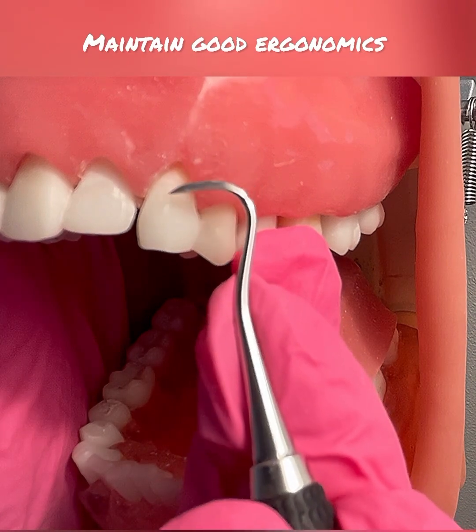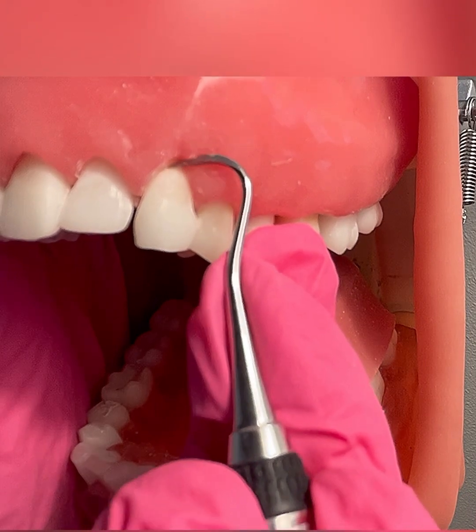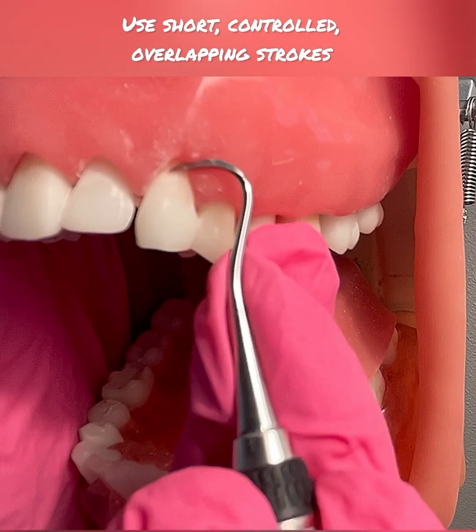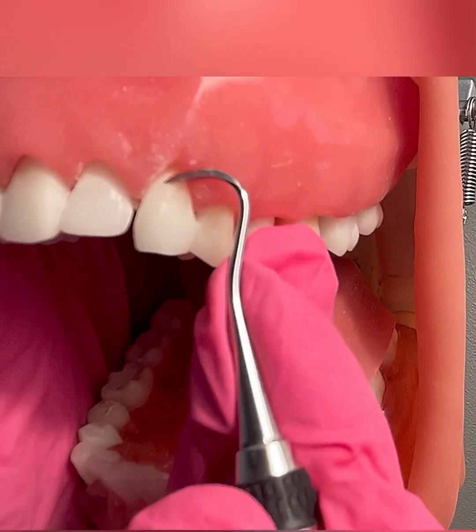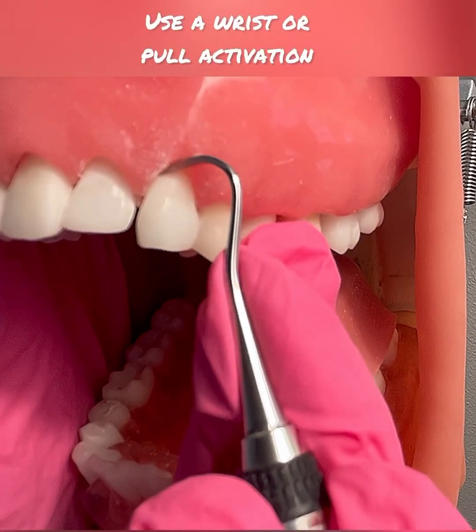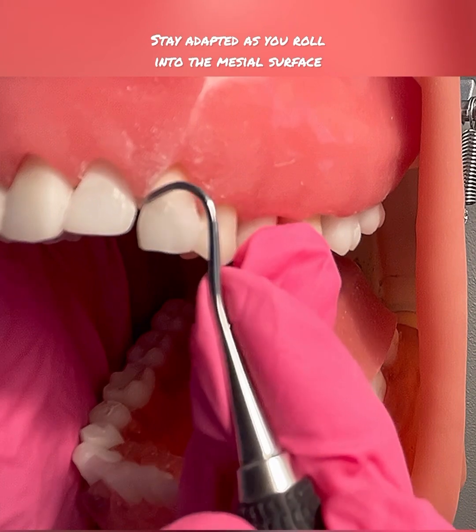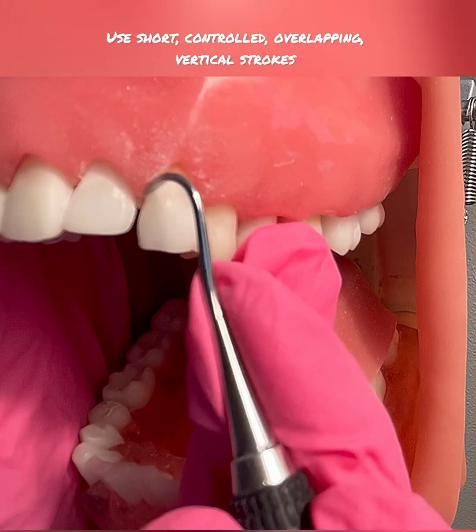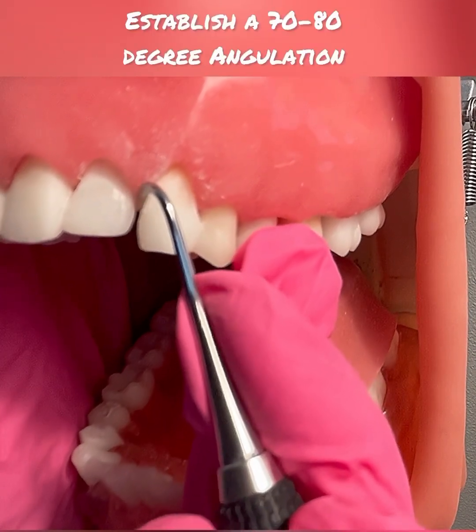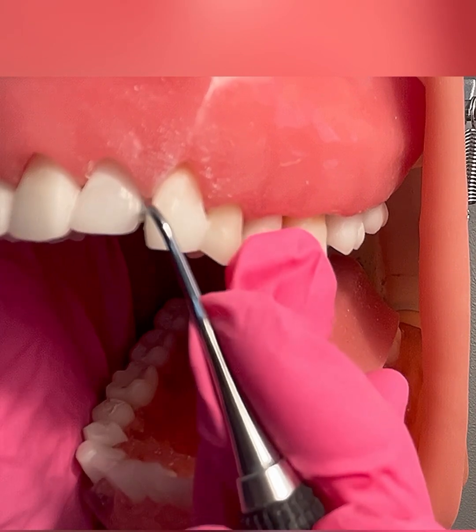If there is an imaginary line right down the midline, I am going to adapt just the tip third right around that midline. I'm going to start by using overlapping vertical strokes, staying supragingively, adapting the tip third of the instrument. I have an intraoral fulcrum and I'm using a pull or wrist activation. As I come across a direct facial, I'm going to stay adapted and slowly roll into the mesial interproximal, maintaining my modified pen grasp, establishing a 70 to 80 degree angulation. As you can see, my shank is slightly over at that mesial surface.